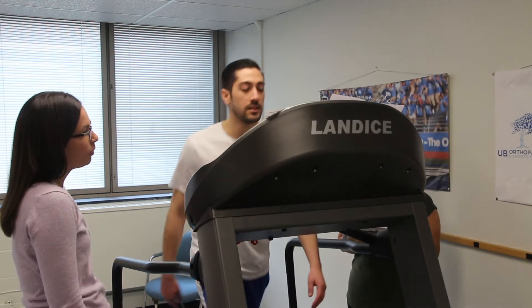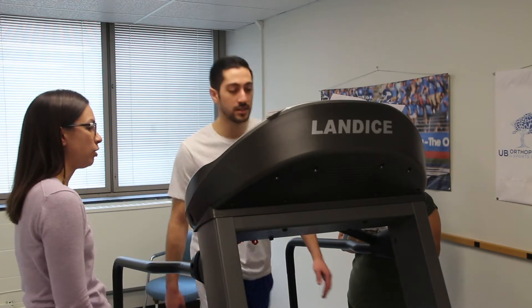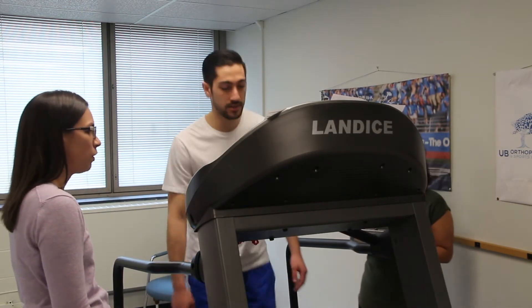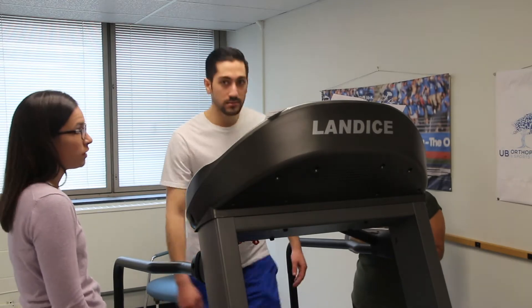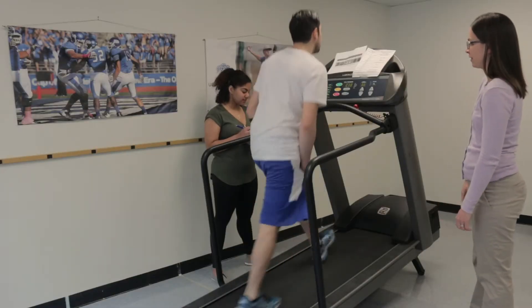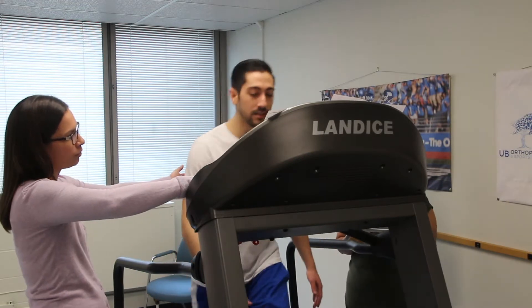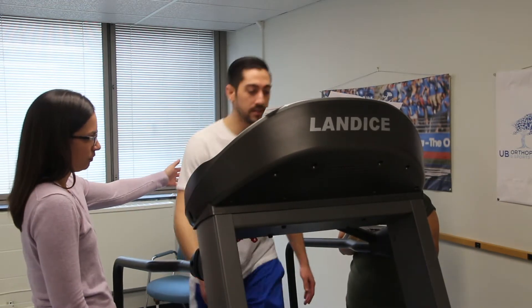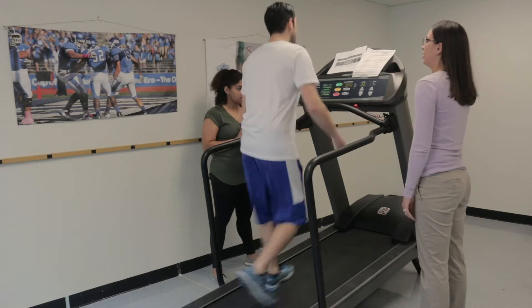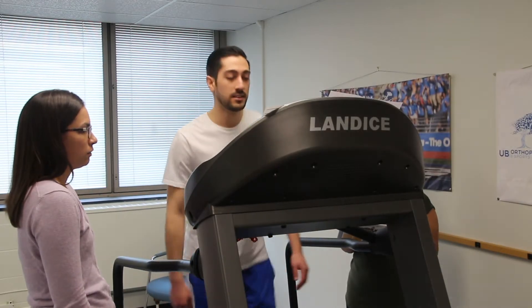Initially the treadmill is set at a speed of 3.2 miles per hour. We increase the speed for someone who is tall or in very good condition and expected to come close to maximum. We adjust the speed down for anyone who is not so tall and for children. Every minute, the treadmill is raised one degree, thereby increasing the workload systematically.